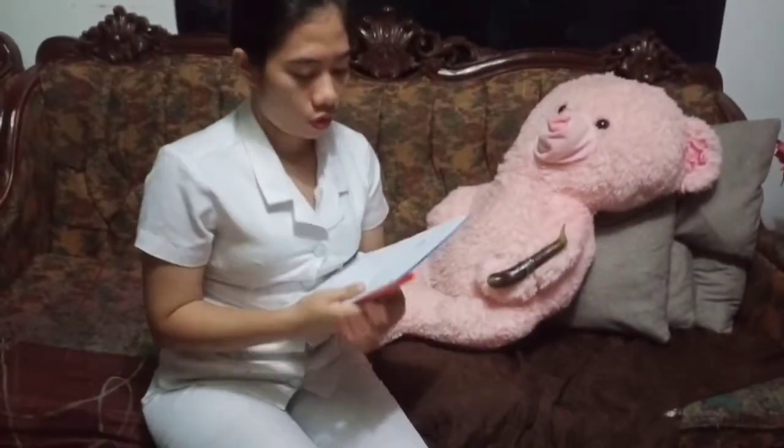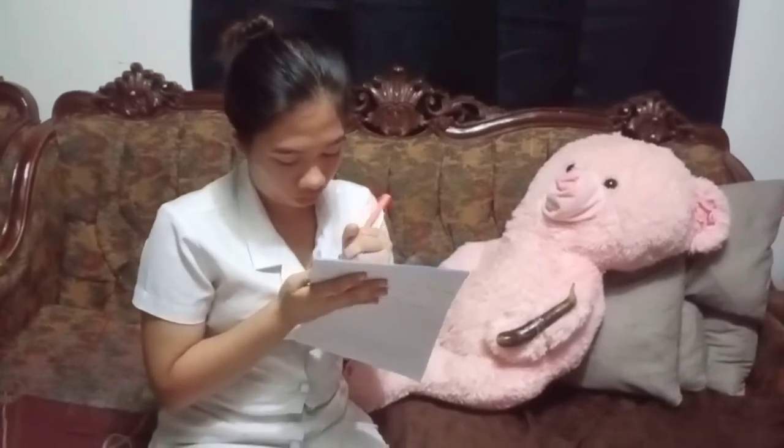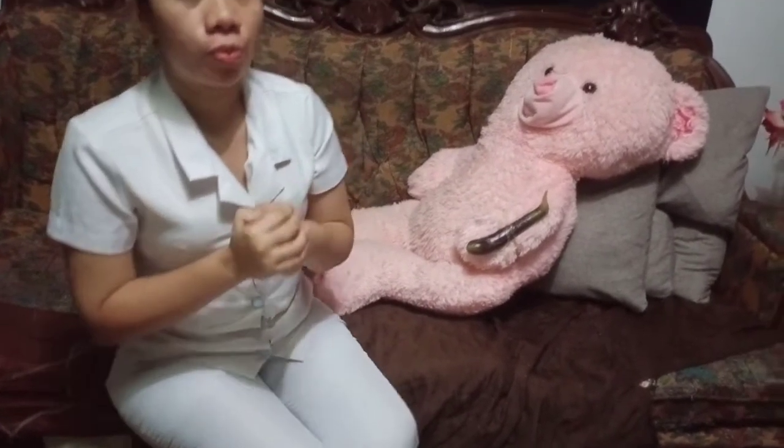Then document the relevant information, recording the testing material given, the time, and the dosage. Then evaluate the condition after 30 minutes, depending on the test. Measure the area of redness and induration in millimeters at the largest diameter and document findings.